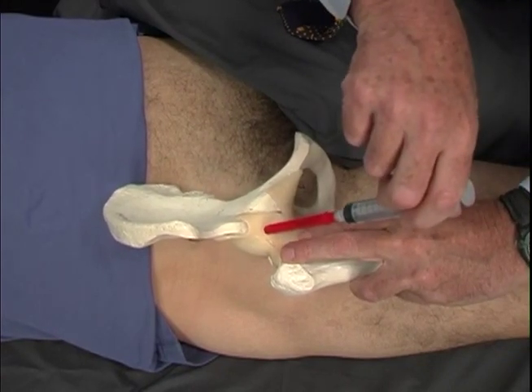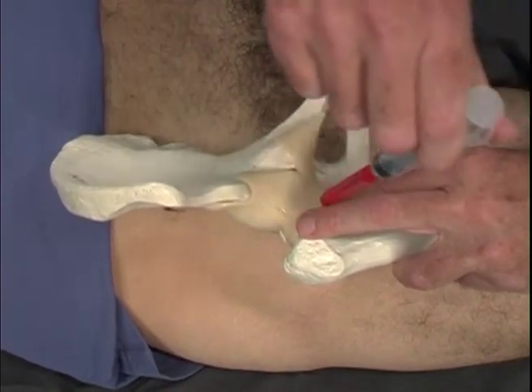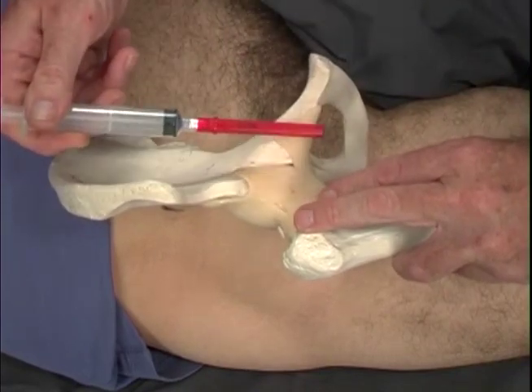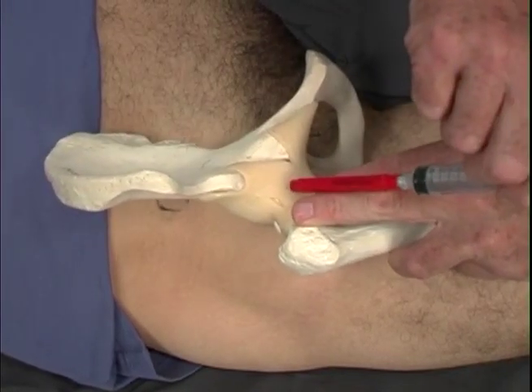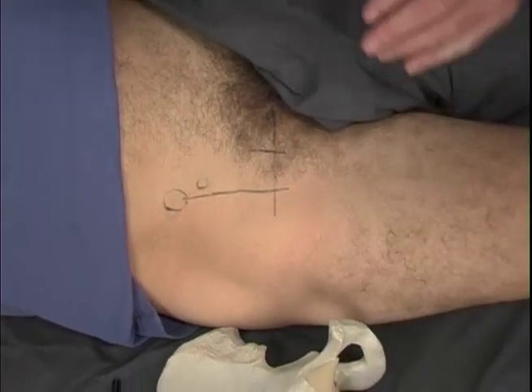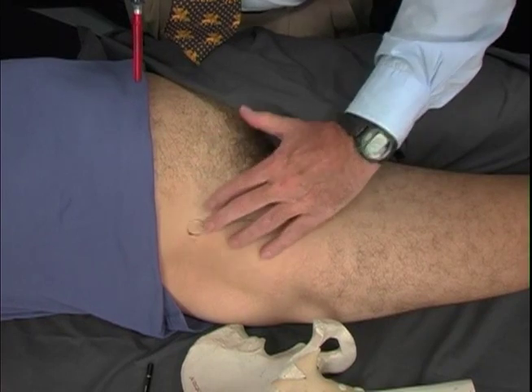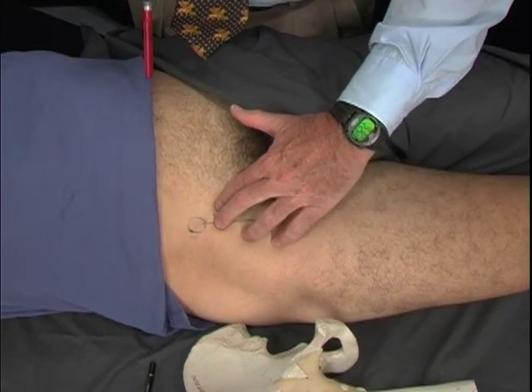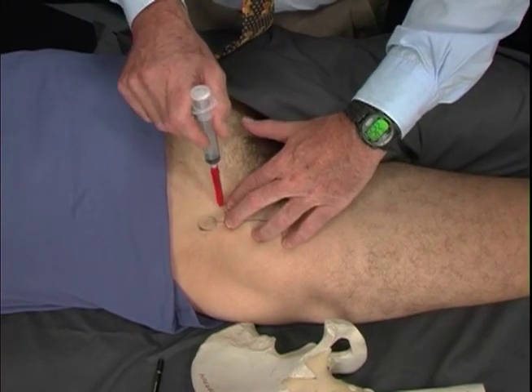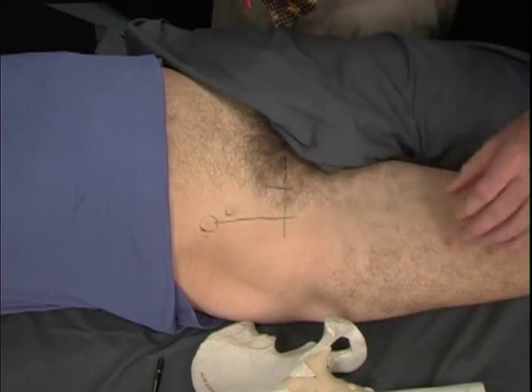Again, important to always feel bone and inject on the bone in this area and going underneath the artery and nerve and vein that we know are medial to our needle entry point. The anterior superior spine, if it's tender, and the inferior spine should be injected as well. More often, the inferior spine seems to have tenderness than the superior spine.